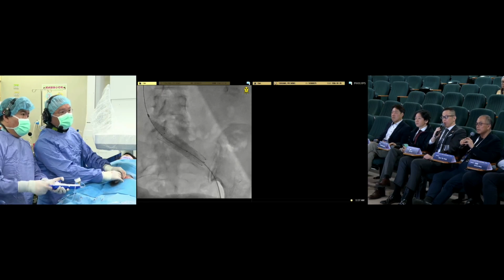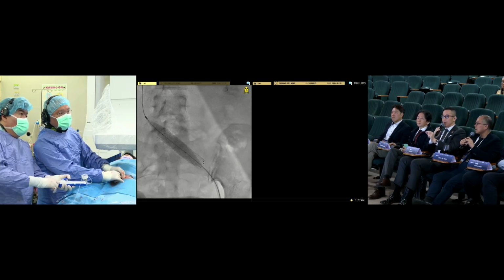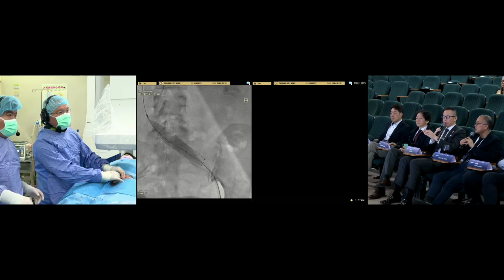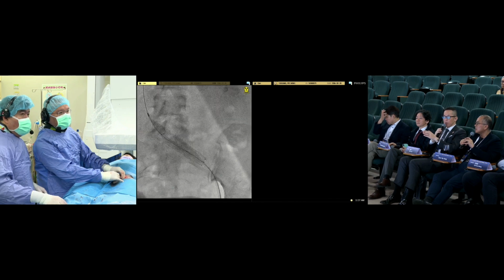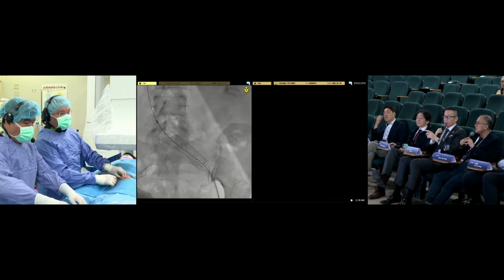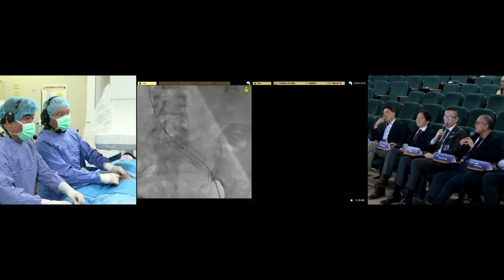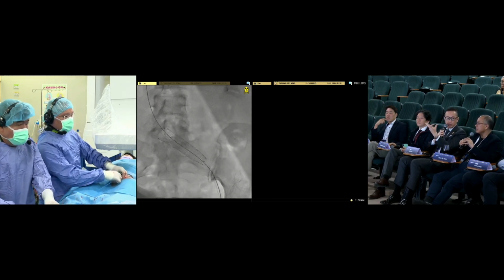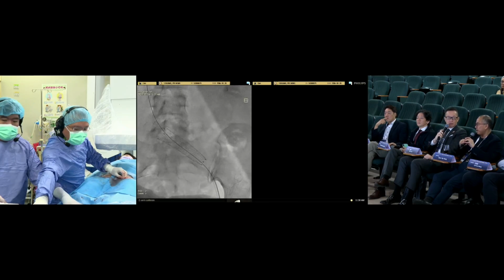For me, I will go 5 millimeter longer than the lesion. But last time, in a collaboration with my good friend Human Jaleh, with the lab demonstration for 5 venous stenting cases, he suggested only 2 millimeter longer, approximately, especially for Venovo because they have the flare, a 3 millimeter flare at the end of the stent.